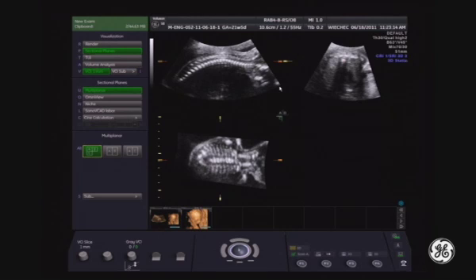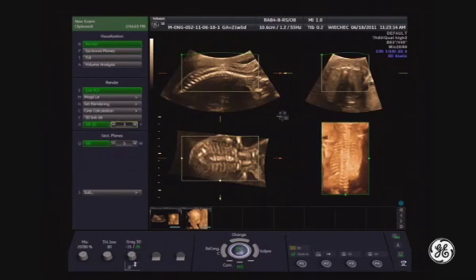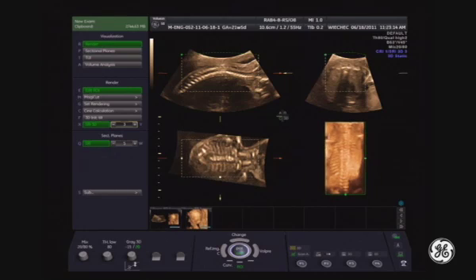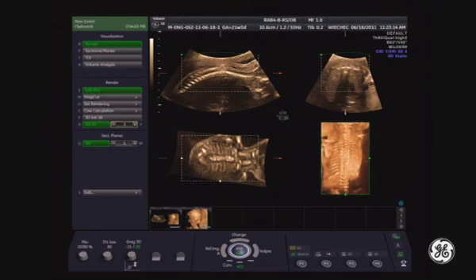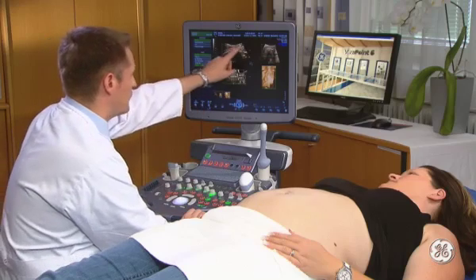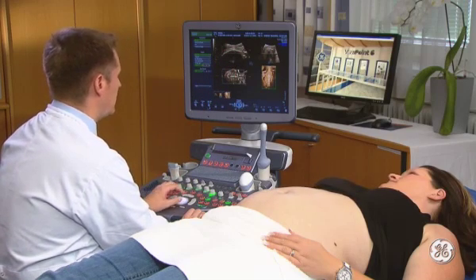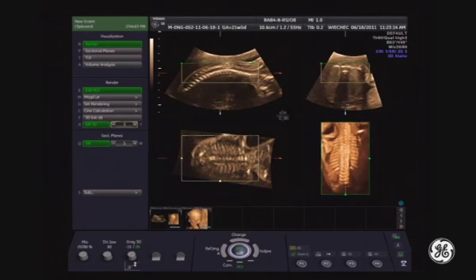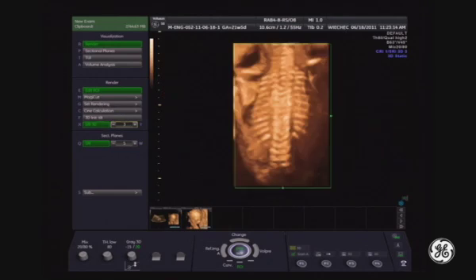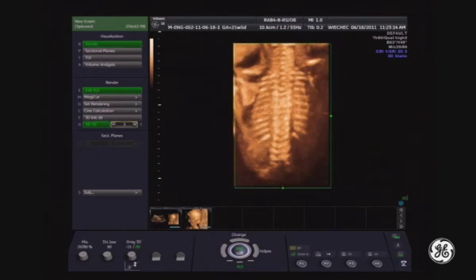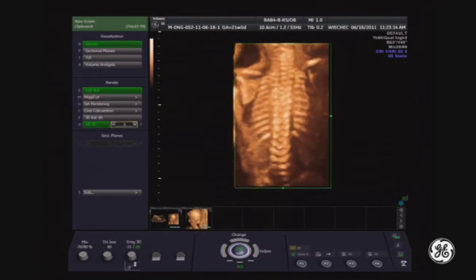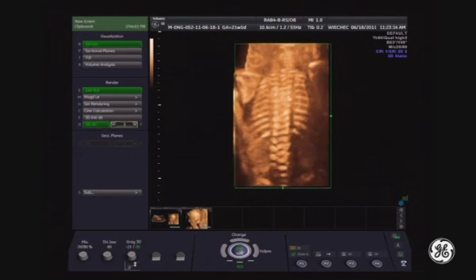Let's try how it goes. From the multiplanar view I switch to render. I need to reduce the size of the rendering box displayed here, because when I make it smaller it will be more readable. The result is seen here — this is the fully rendered image of the fetal spine, and by rotation you can review it.